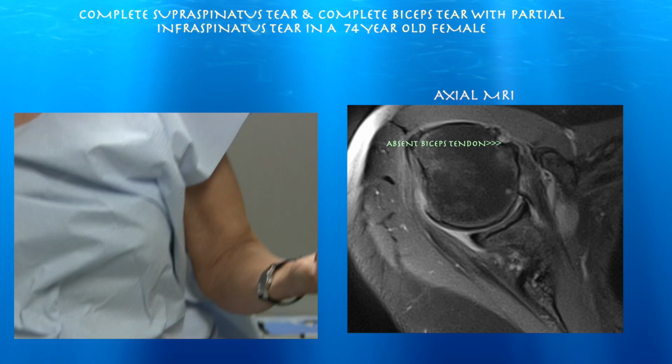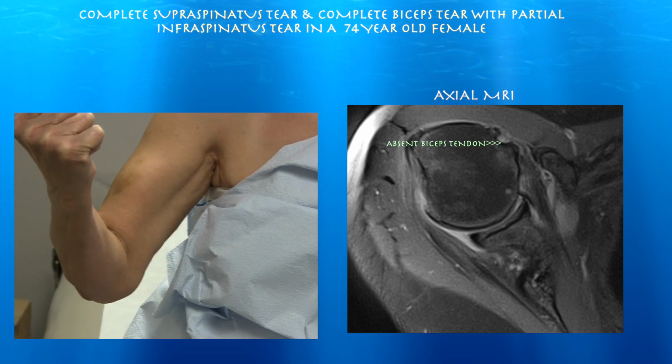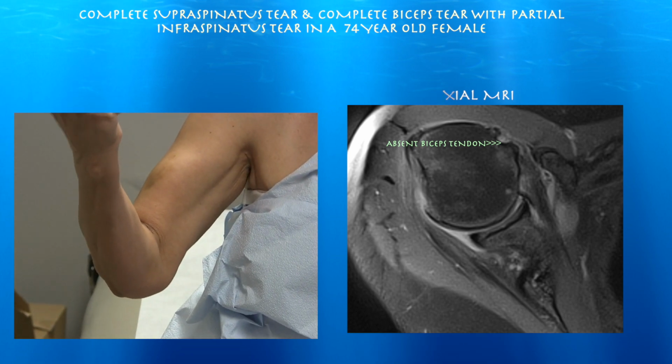And flex your other one. You see the shape of that one is different. It's a little more elongated. That one kind of bulges. Really make a muscle hard on the right side.